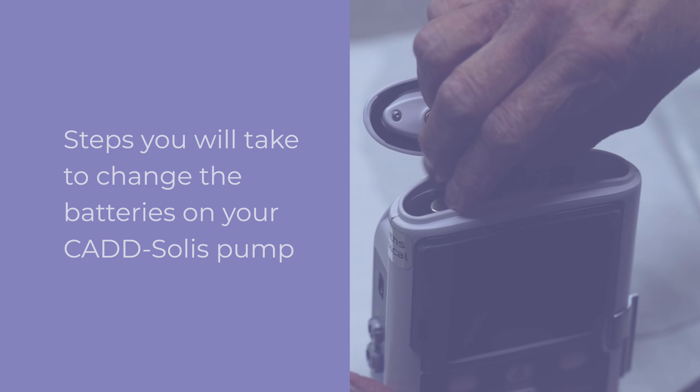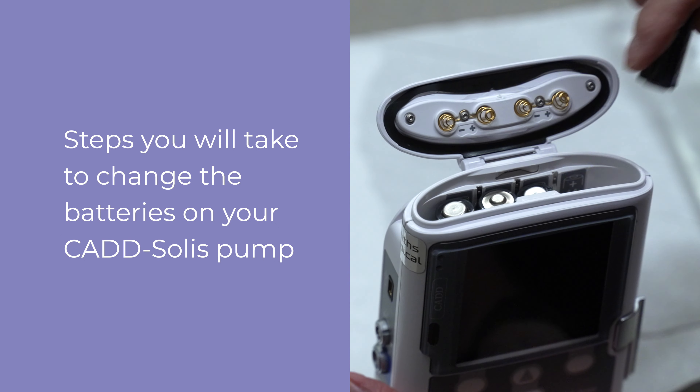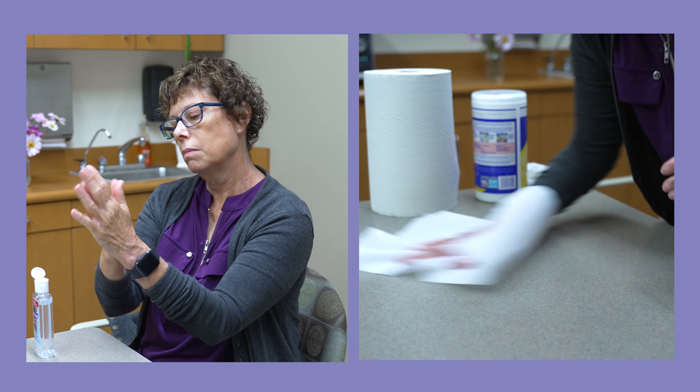Thank you for choosing Sharp Home Infusion Services for your home IV therapy needs. Please follow these steps to safely administer your IV therapy at home. This video covers the steps you will take to change the batteries on your CAD Solus pump. As always, first wash your hands and prepare your work area as described in video one.